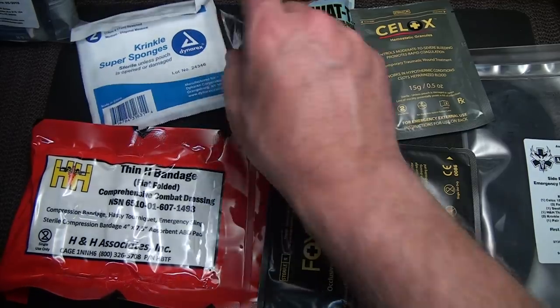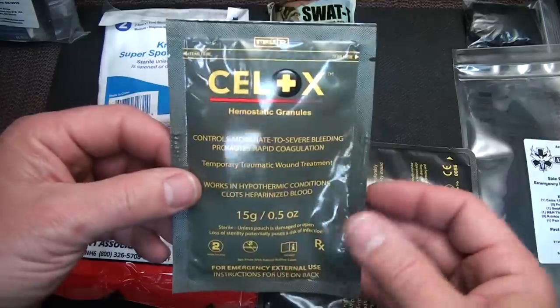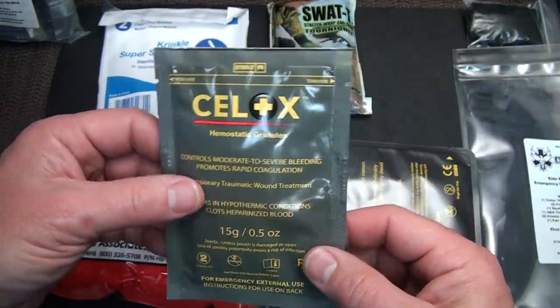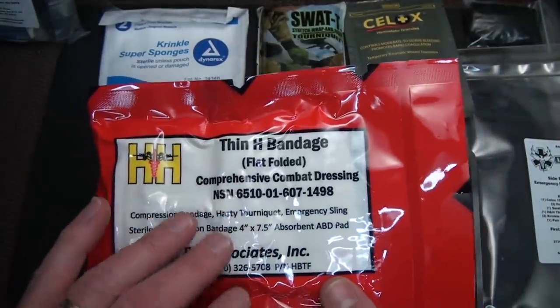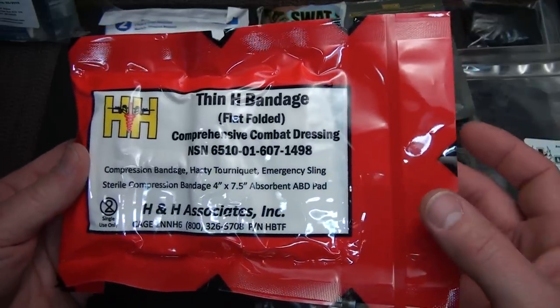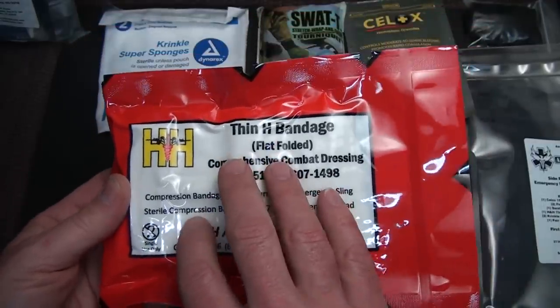Of course, the first thing, you have your black nitrile gloves that are large. These are very durable. You have your Celox, which is a hemostatic agent that's going to stop the bleeding. And again, you have your SWAT-T tourniquet. But here we have more of an advanced H&H bandage, and this is flat folded. It is a compression bandage, a hasty tourniquet, an emergency sling. You can use this for a number of different things.